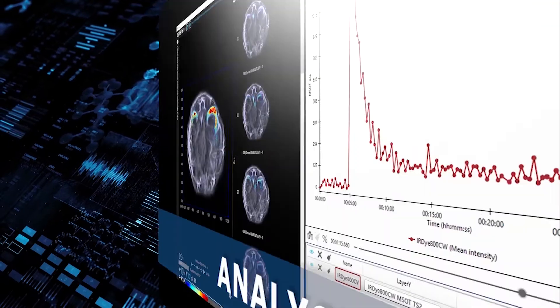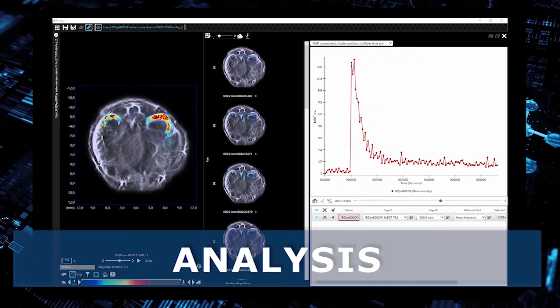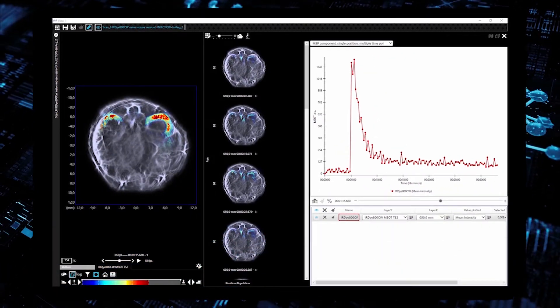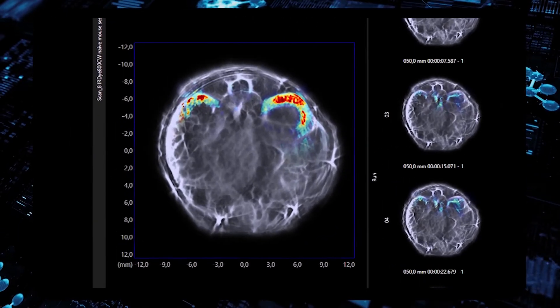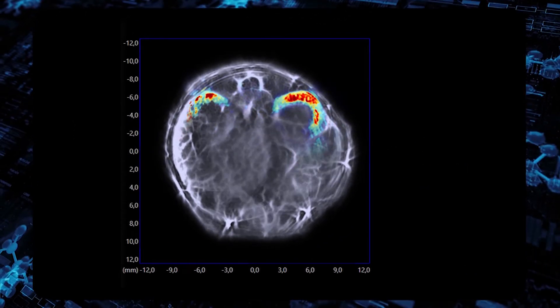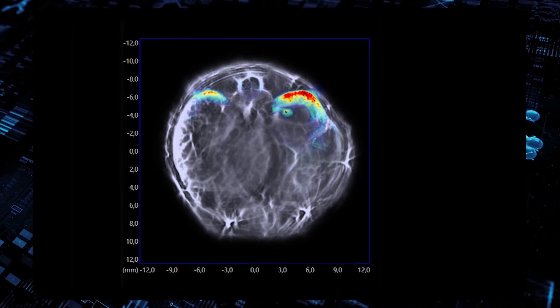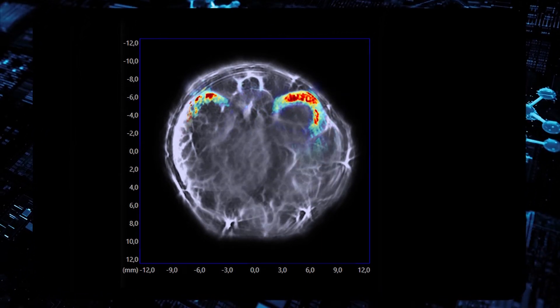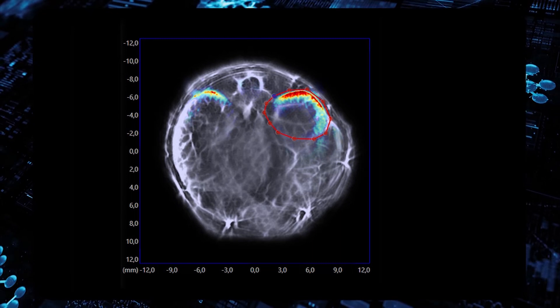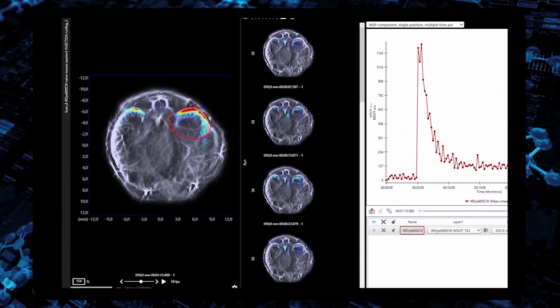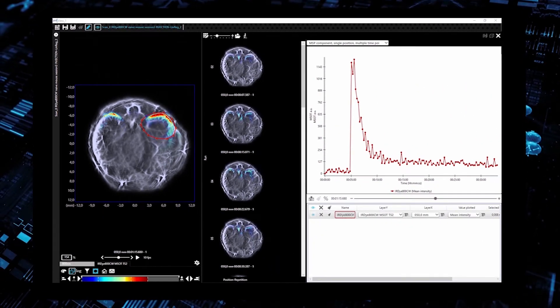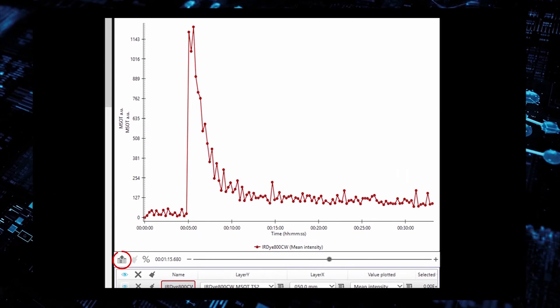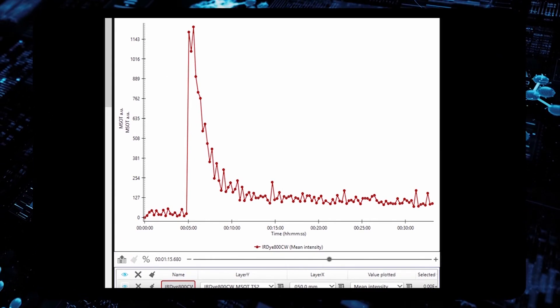The final step in data post-processing is quantitative analysis. The user first has to choose the region of interest. A plot then shows signal over time, which can be exported for further analysis.